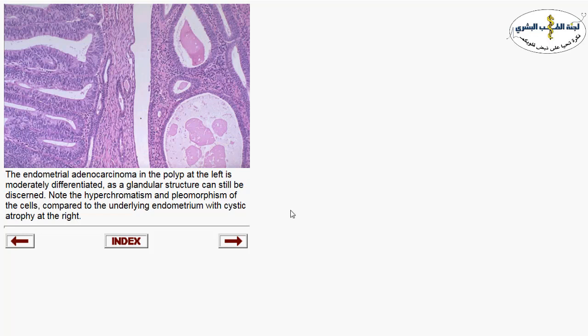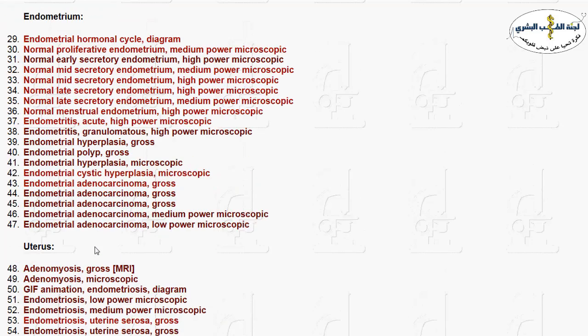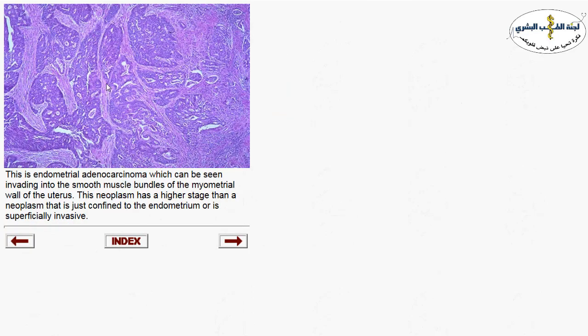When the endometrium is affected by atrophic changes, the glands usually become cystically dilated. Another picture of endometrial carcinoma shows back-to-back glands, cribriform pattern, bridging, and atypia.